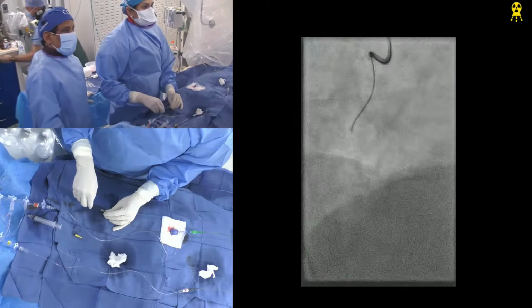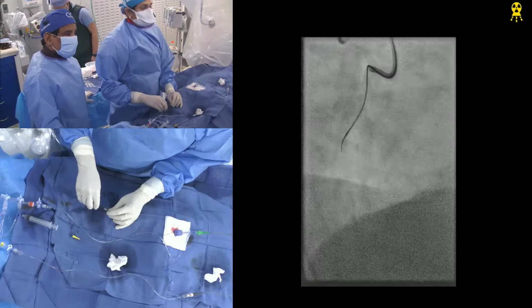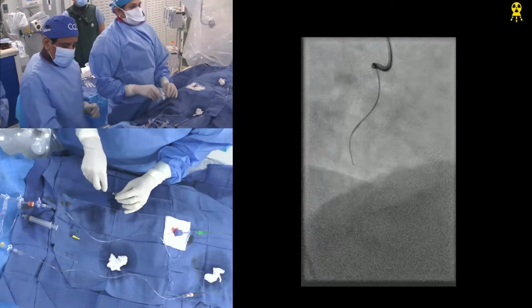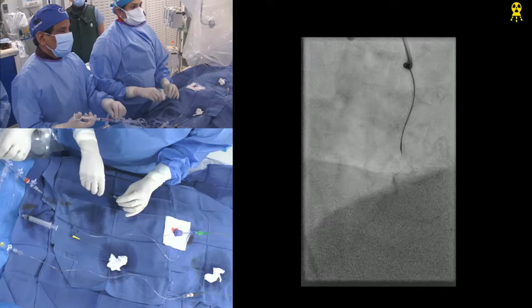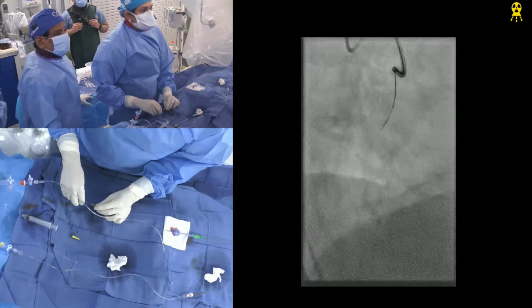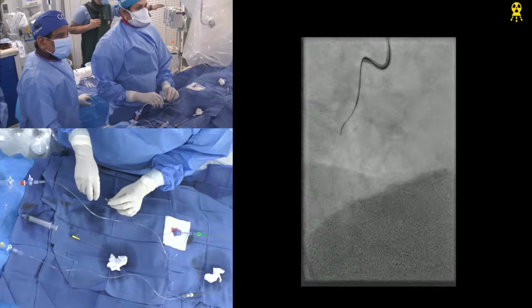The same escalation which we showed. Absolutely. Fielder. Yep. Then your second is Miracle. Then you go to Confianza versus the Gaia 3. So want to take a little picture? See there? We are subintimal. Went into a bridge collateral, right? Looks that way.